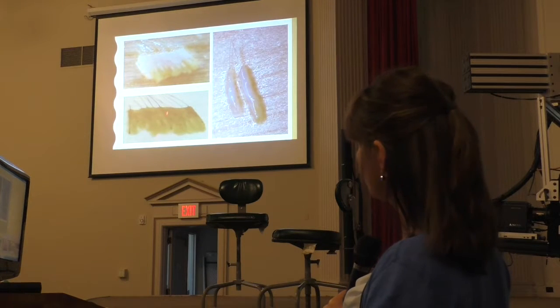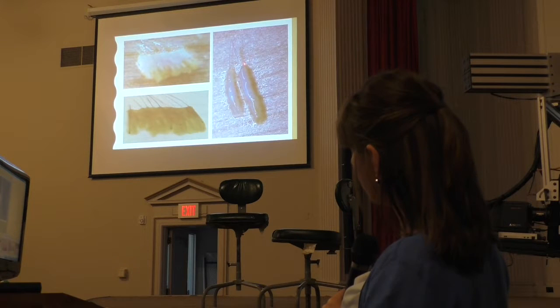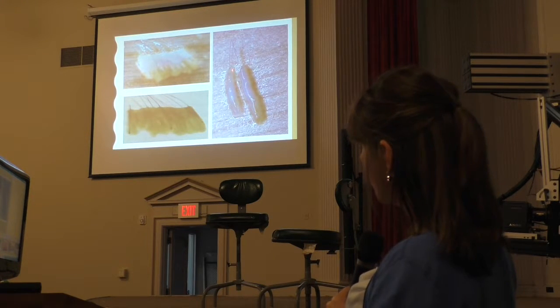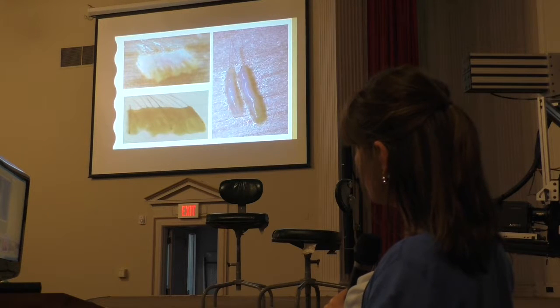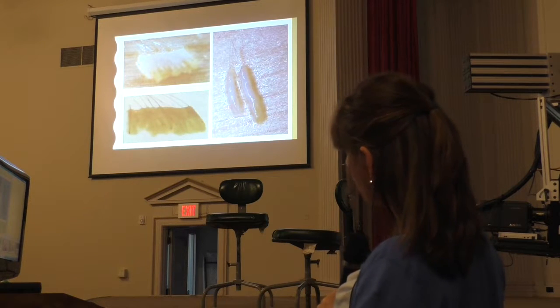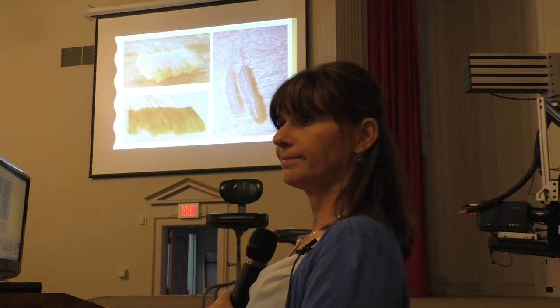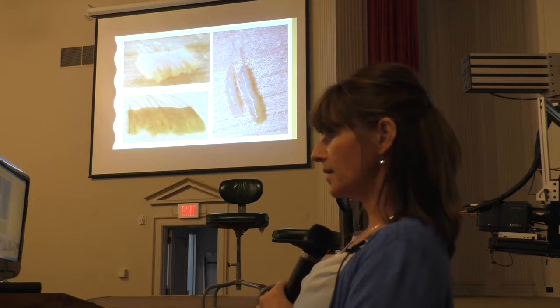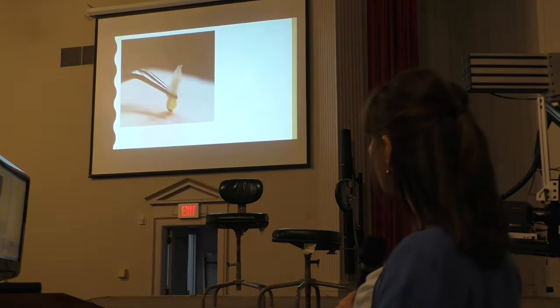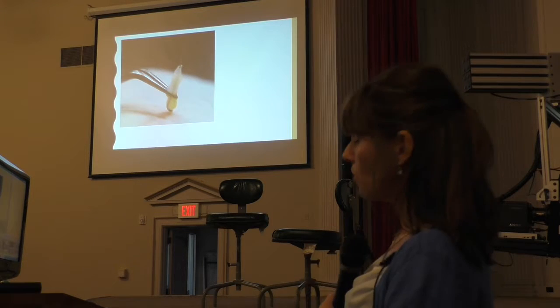So that could be a good help when you're slivering and dissecting the white hair. When making grafts with 1 hair, I find one that has a full length. That becomes my measuring stick. If any grafts are shorter, that tells me this is transected, because oftentimes you can't see the bulbs. If I see these pointy little grafts, that tells me that all bulbs are transected. So start with a good one, and keep it there to remind you how long it is. This graft, what's wrong with this picture?